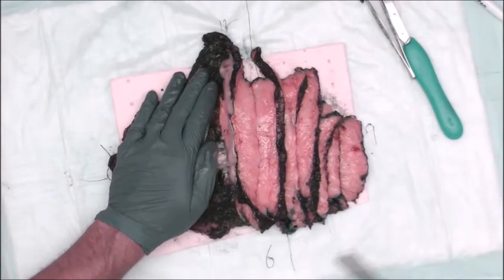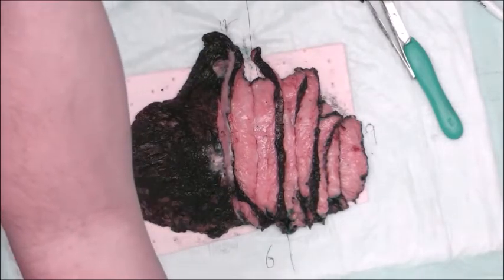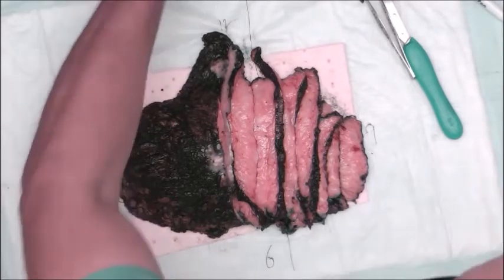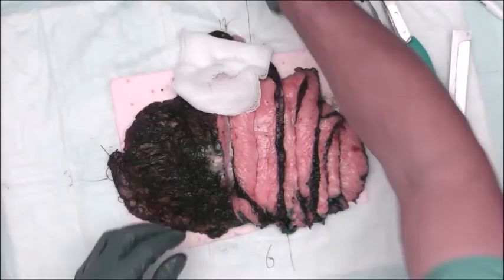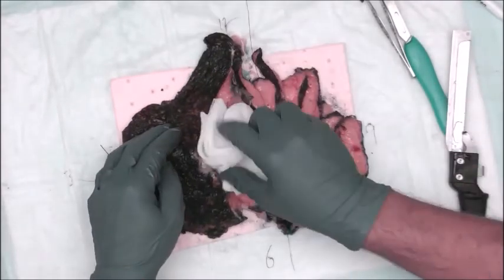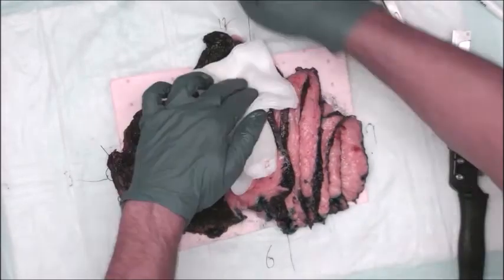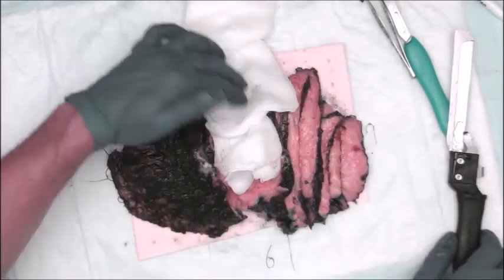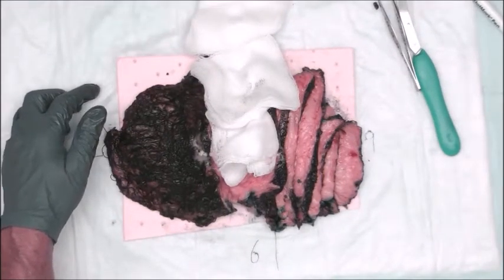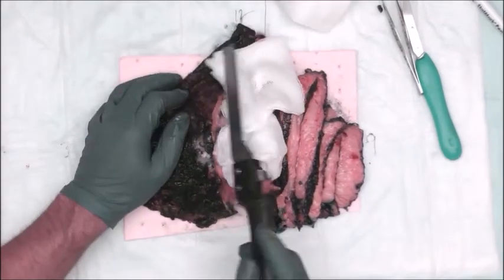And as you just noticed when I cut through there, a bunch of, I don't know if it's abscess or if it's the consistency of the tumor itself, but a bunch of this mucoid type of material came out, which I was not expecting. So we're going to stick that in there and try to soak up some of that before it gets everywhere. I don't see that very often. Maybe just a bunch of necrosis as well. I'm rinsing between each slice. Once again.